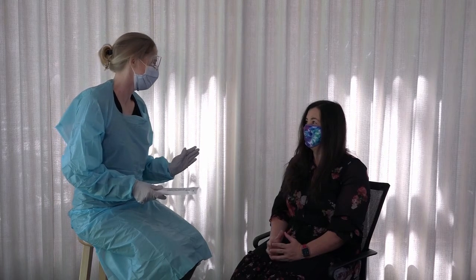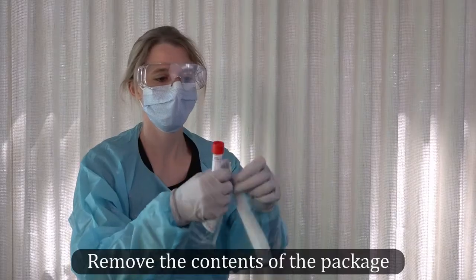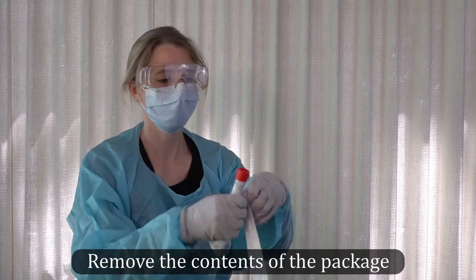Advise the patient that you will collect the specimen momentarily. As needed, remind the patient that the procedure may cause them temporary discomfort but will last only a few moments. Unwrap the swab being careful not to contaminate its tip.